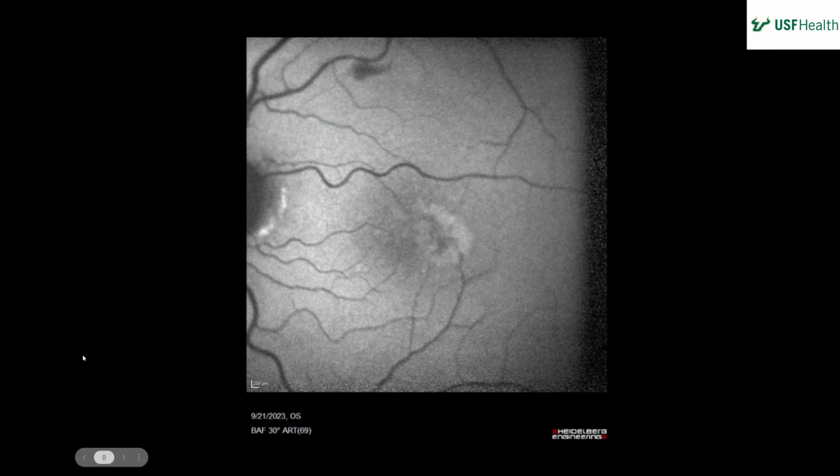Bryan or Madeline, you want to chime in? Is it Henle's layer? Not really. It's the pigment. So it's hard because you have to know all the normals in your head, which you guys don't have yet. If you don't show a normal autofluorescence in the presentation, maybe I'll show you one later, but we'll see one today probably. The normal autofluorescence has a big dark spot in the middle, and that's the macular pigment. In this particular disease, it's almost totally missing. I mean, it's remarkable.